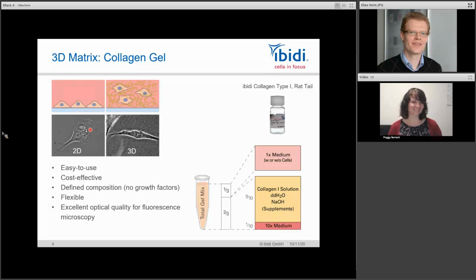It's described this way, as 2.5D. You can try different things. I don't have a short answer. It is a lot cell type specific. Some cell types like just hard surfaces, and whenever they find a hard surface, they attach there.